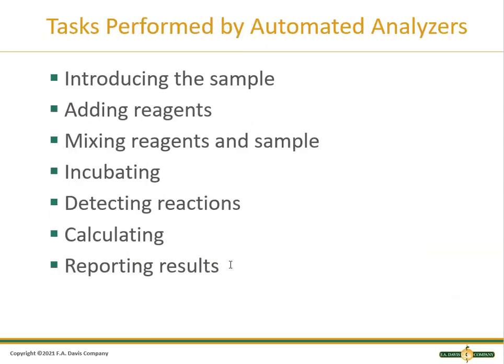So automated stuff: put the sample in, it adds the reagents, it mixes the stuff, it incubates it, does a reaction, detects it, calculates it, reports it out.